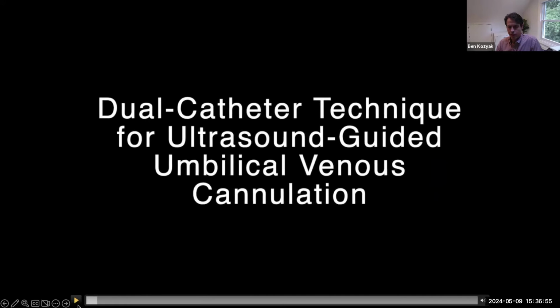Okay, so in this last fourth video, I'm going to show you how the line over line technique works and how you can augment that further using ultrasound. I think a lot of people who are neonatologists or have placed UVCs in the past know that there's a technique where if you can't get your line to go after multiple attempts, you just leave it where it gets stuck, and then you follow it with a second catheter.